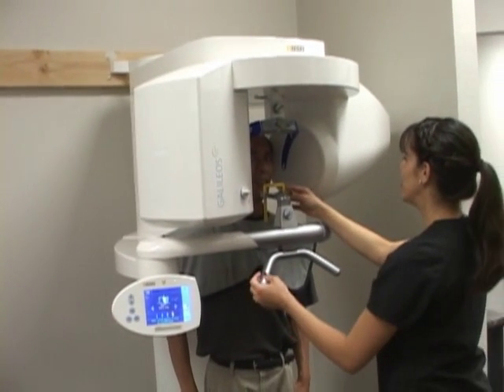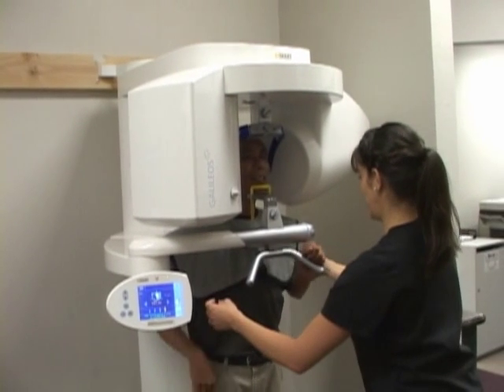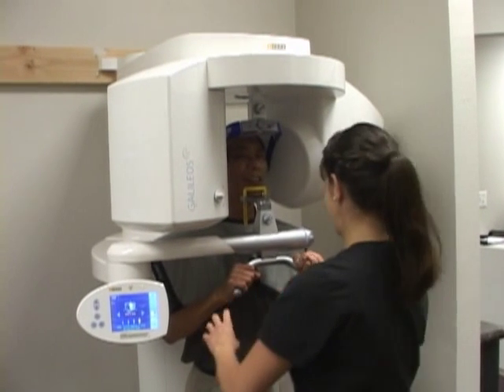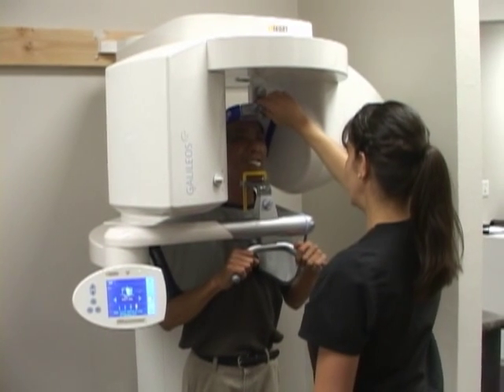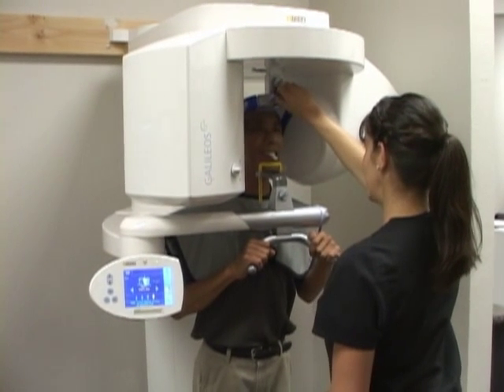Okay, if I can get you to rest your chin on this gray piece here, move your hands up to these handlebars here, and I'm going to have you bite down on a cotton roll. Right here. Move your forehead forward slightly. Okay, I'm going to tighten this around your ears here.